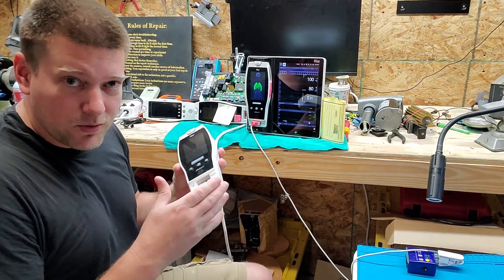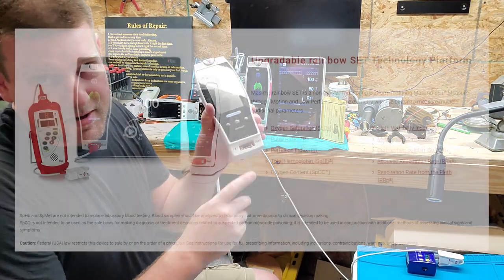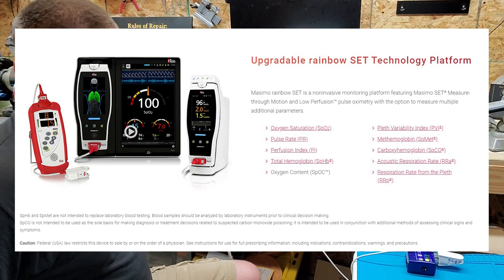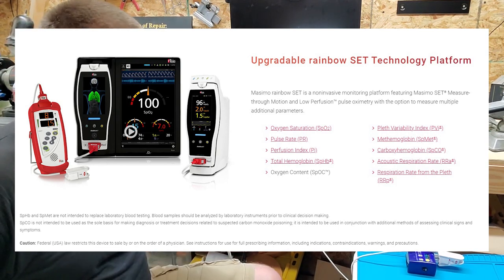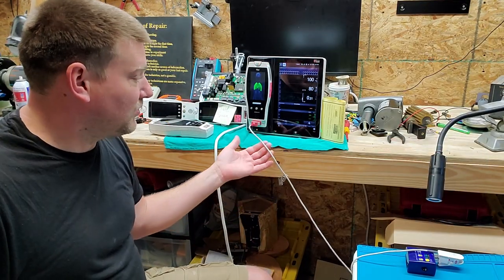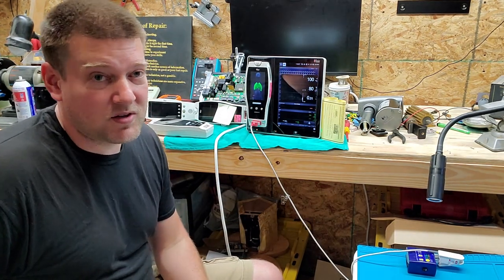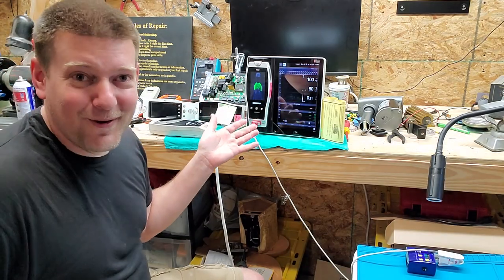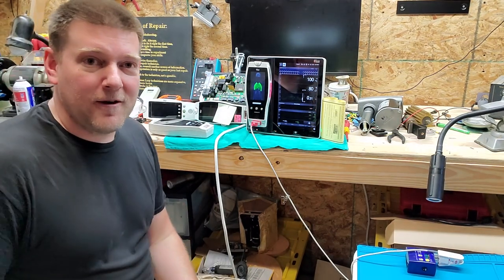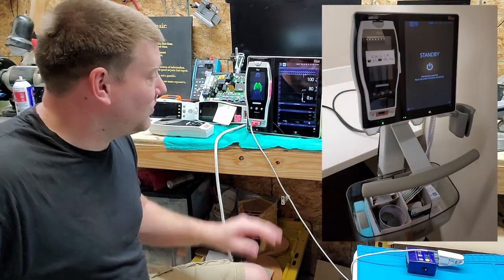Here we have the Radical 7 — it's a very neat-looking unit. Normally it's an SPO2 pulse oximeter, but these have something called the Rainbow SET, which allows a whole bunch of other parameters to be incorporated into this port — it's not just for pulse oximetry. Yes, it can be very expensive. A typical Rainbow SET SPO2 probe, when you get the trunk cable plus the probe itself, is hundreds of dollars. But in the end it's a very cool setup, or at least it appears to be.